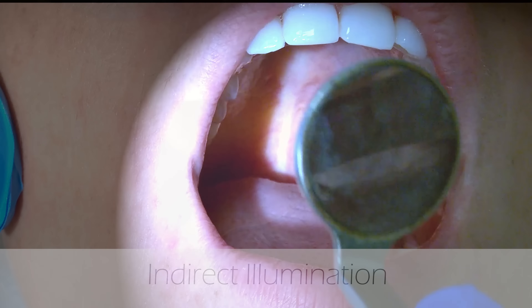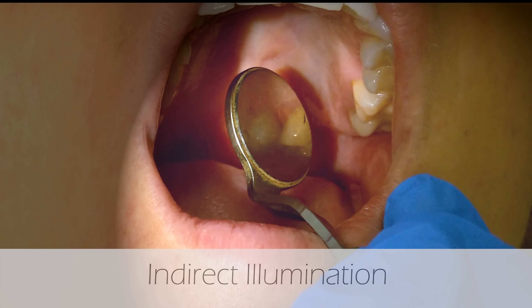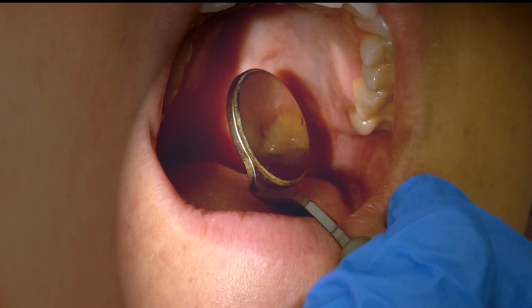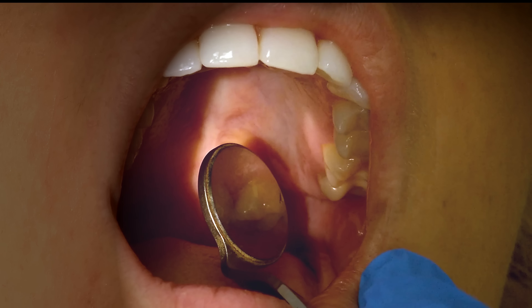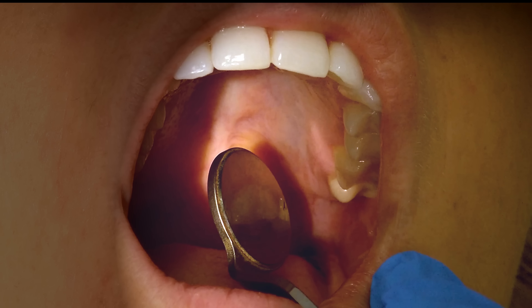The fourth is indirect illumination. This will shed more light in the area. For example, here you can see with my mirror I can direct a little more light onto the lingual of number 14, and this allows me to see the area better as I'm working.